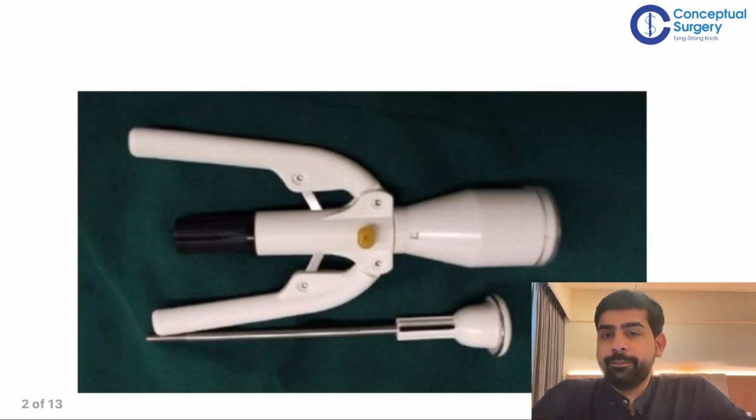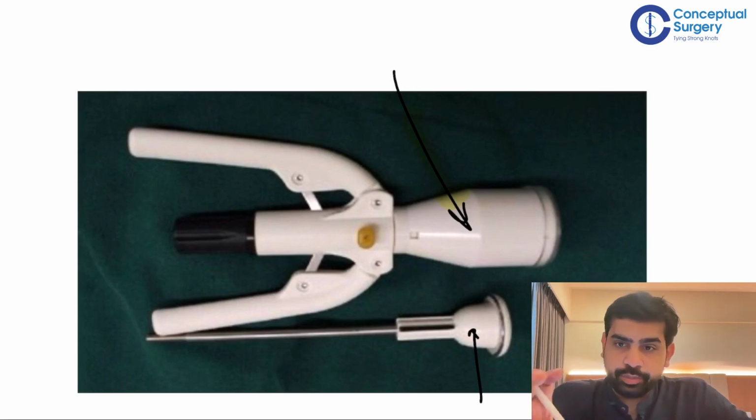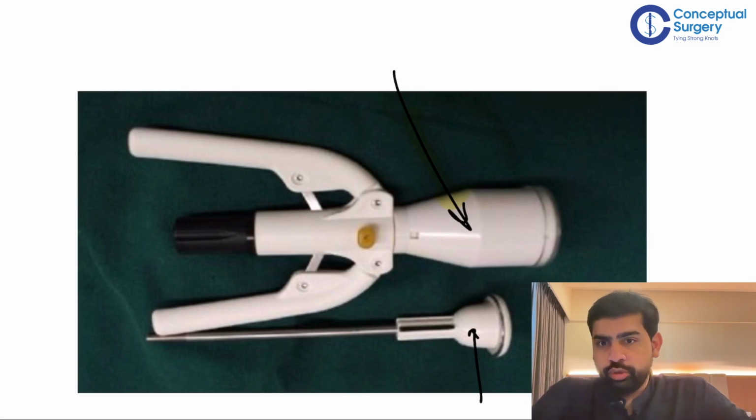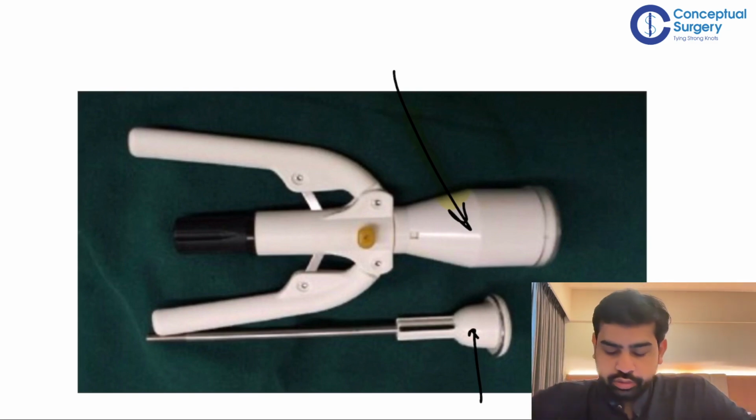Like any particular stapler, this is the device which you basically get. This is the external apparatus, whatever you want to call it. And then this is a part, the anvil kind of thing, which goes inside the glans and the prepuce skin. I'll talk to you about this. So this is how the stapler looks. Now just pay attention over here as well. I will talk to you about all these particular things.